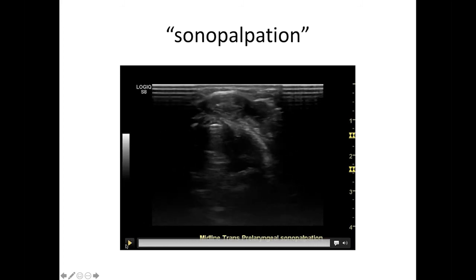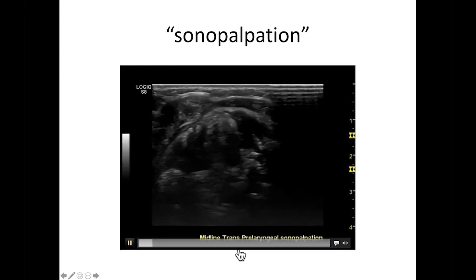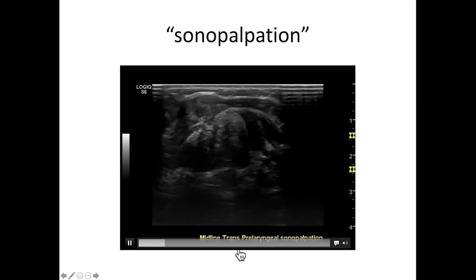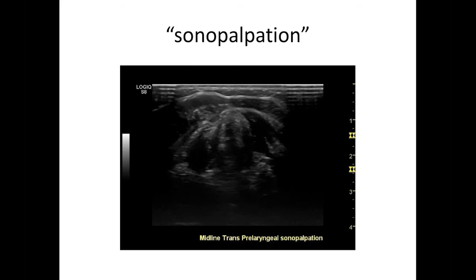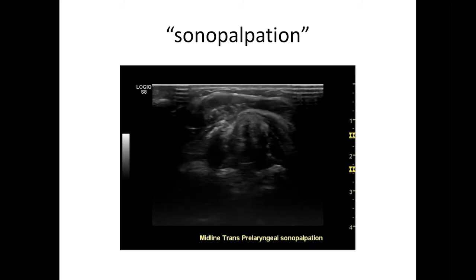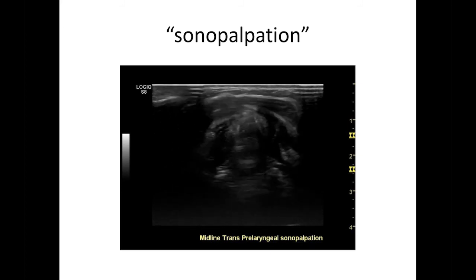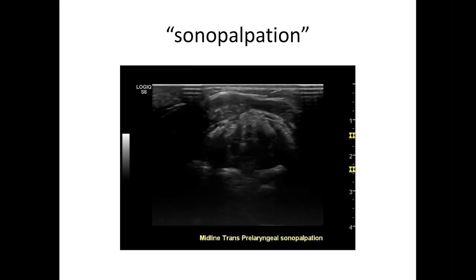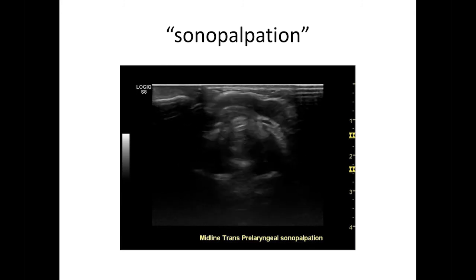I'm going to play that video again, because you can see with sonopalpation this tumor freely moves with respect to the laryngeal cartilage. If you're pushing it with your left hand while scanning with your right, you can see it sliding over the laryngeal cartilage.